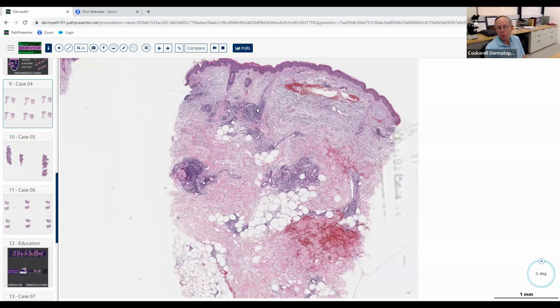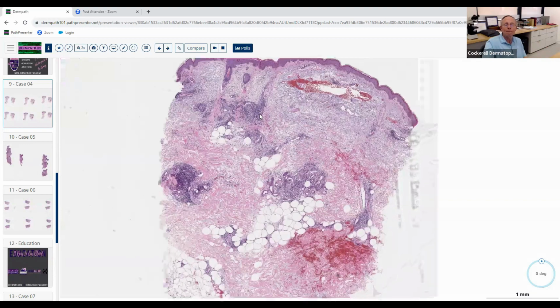The tumid form of lupus gives you a lymphocytic infiltrate primarily. And if you look in the dermis with that, you'll see mucin. So that's how you really make that diagnosis more specific. So if you see lymphocytic infiltrate with mucin, think of tumid form of lupus. So what are some of the other L's that we think about?